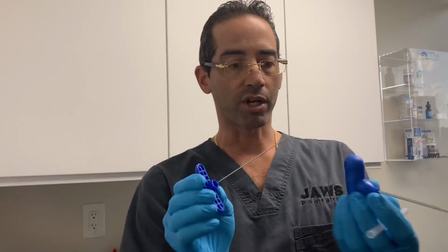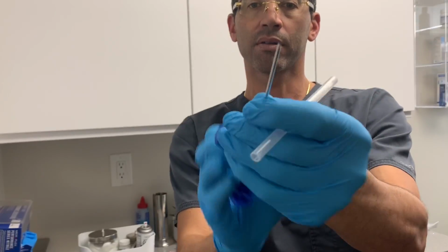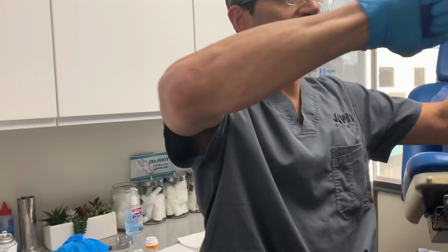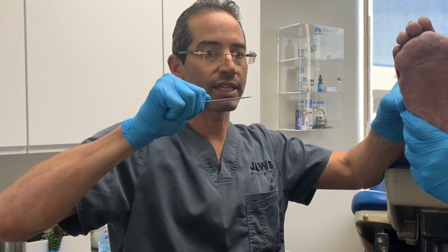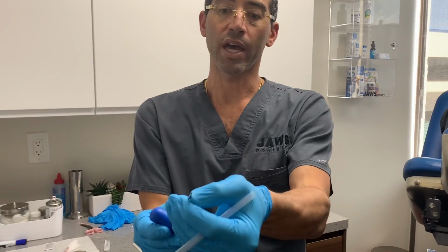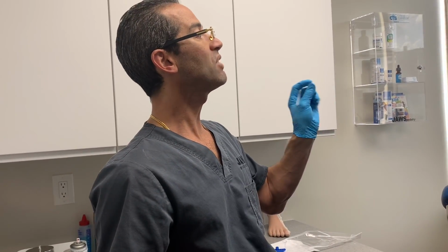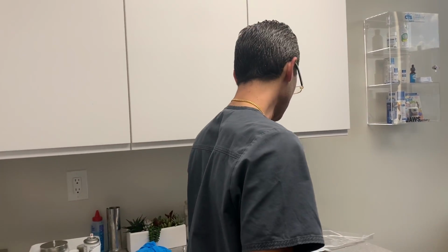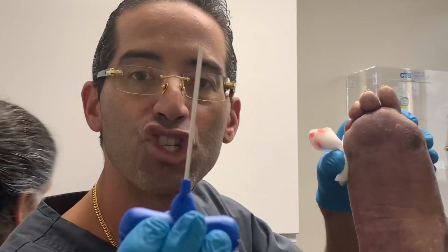This is how it works. This is super duper sharp, okay? I go like this, there's a tip. It's got a core. You see the core there? What I'm gonna do now is drive this into the bone, not too deep, take it out, and then we'll have bone there. That's a specimen that we're gonna send out to have analyzed. I'm just gonna take a little piece of the bone. And then we're gonna use this little other hook to hopefully take this out, right? Bone biopsy, Jamshidi needle.